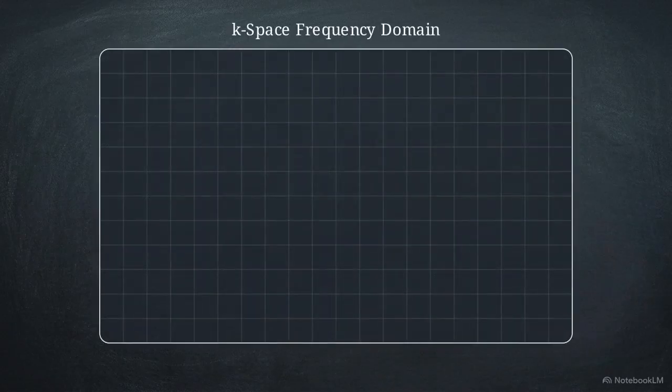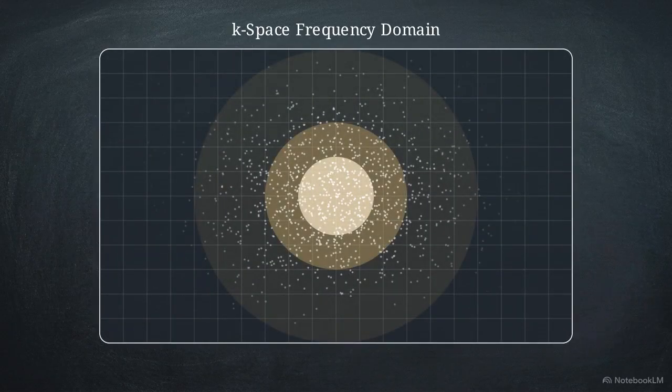This K-space matrix represents the raw spatial frequencies. External variables like static electricity buildup on clothing or faulty equipment leaking spurious RF signals inside the room can inject a surge of noise into the collection process. This registers as a bright anomalous spike in a specific data point.